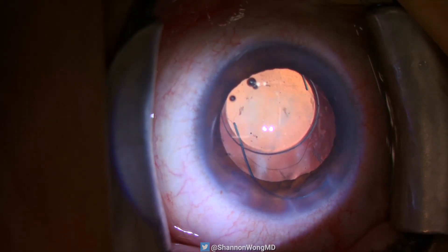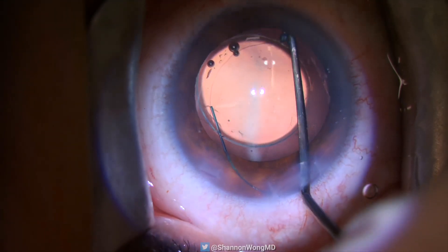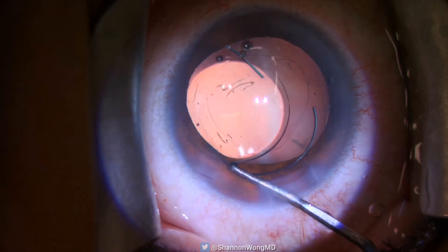Because the LI-61AO is an aspheric lens, small amounts of lens decentration are inconsequential. But we still want the lens to be as centered as possible.